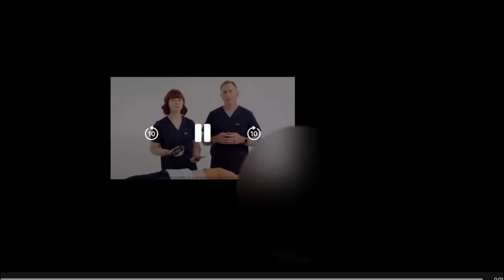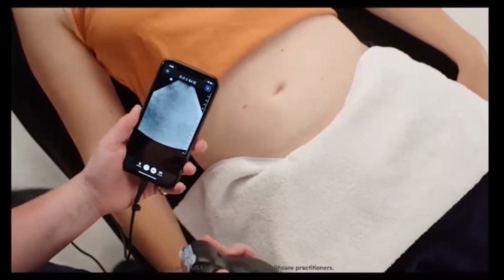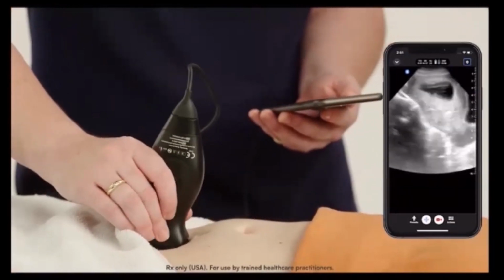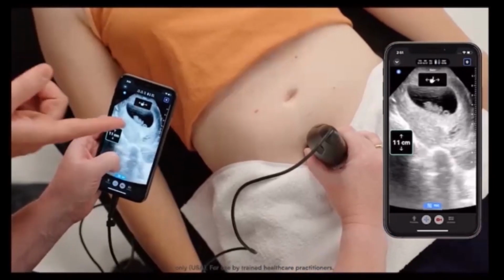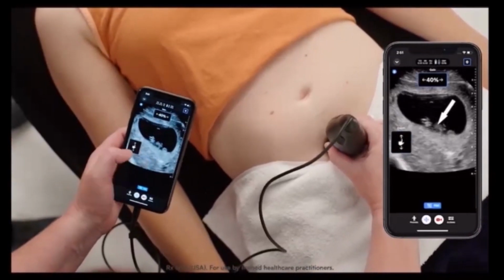This is the use of M mode scanning for the fetal heart rate. In early pregnancy, we'll often measure fetal heart rate using M mode. So we're going to demonstrate how to do that with Butterfly. Okay, we are in the OB GYN preset, placing the Butterfly on the skin and locating the gestational sac. All right, and we've got gestational sac in the center of the screen. You can see yolk sac on the right, fetal pole in the center.